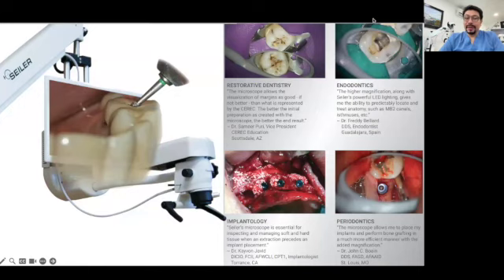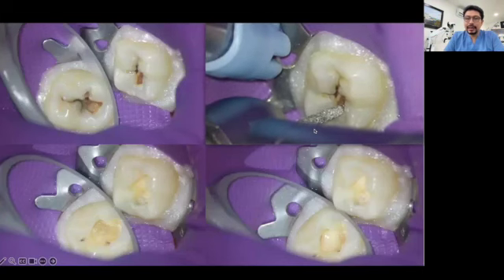With the regular microscope, that is more difficult than with the 3D microscope, because with the 3D microscope, as we will see, you have freedom of movement because you can angulate the optical pod in any direction, and you will have direct vision in most clinical situations. With the regular microscope that you can see here, it is not that easy. You need to stay in a straight position, and you cannot angulate the microscope because it will generate an angulation of the binoculars as well, and you cannot adapt the angulation that the binoculars will take. We will see all these differences during the next slides.